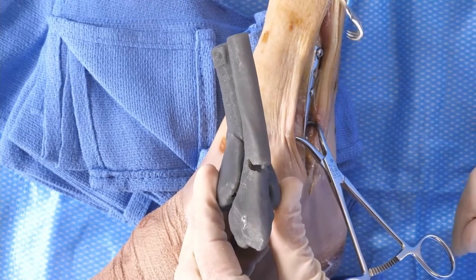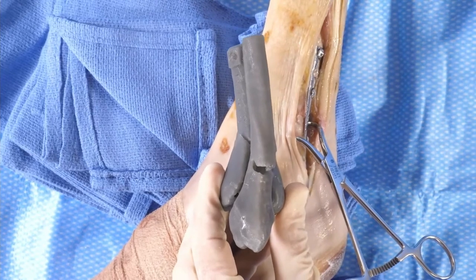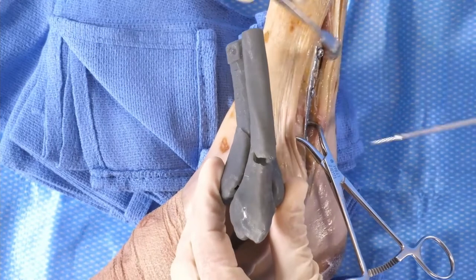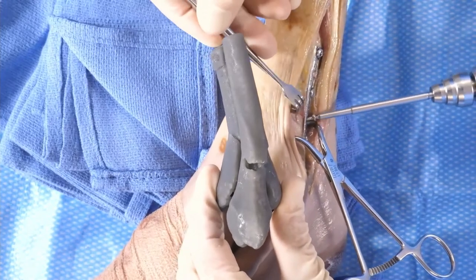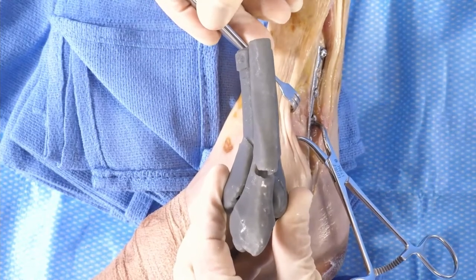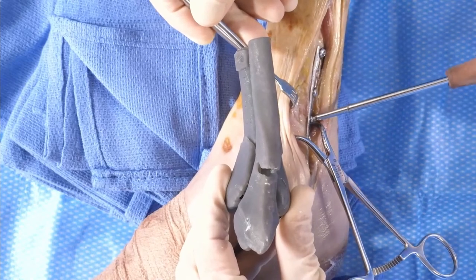In a lot of cases, you want to leave it slightly under contoured, so when you apply your screw, that is essentially going to be the screw that traps the oblique fracture. When you put that screw in, the plate's going to finish its contour very nicely to the back of the bone, and you're essentially trapping one fragment between the other fragment and the plate.